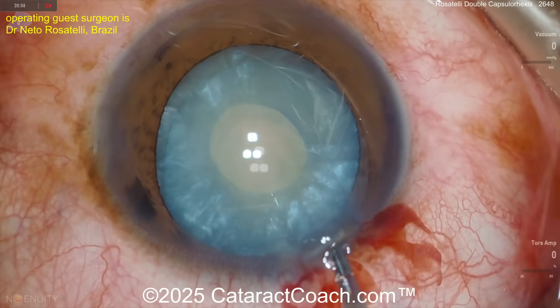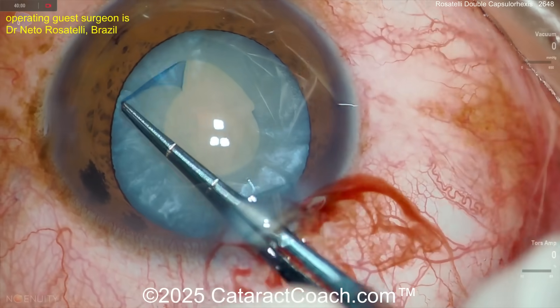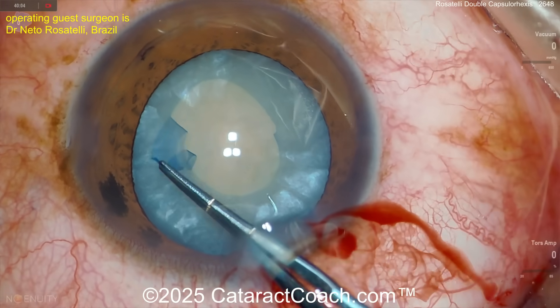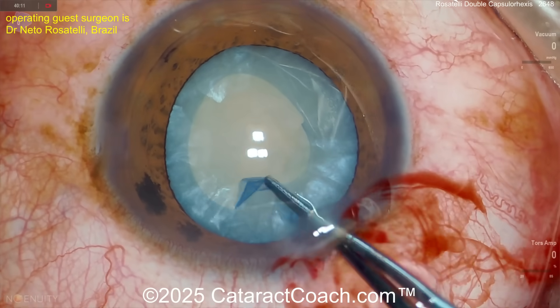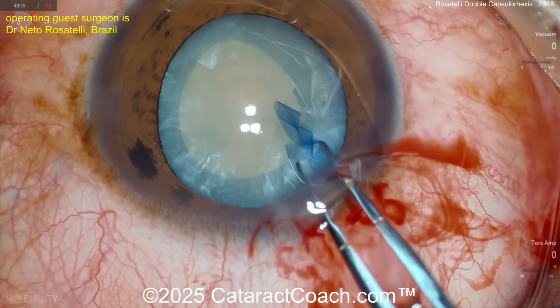Here we go enlarging this now, poking in there and enlarging. This is exactly the rhexis you want — the five-millimeter rhexis. You can see Netto is using forceps that have marks at two-and-a-half and five millimeters, just like I do.